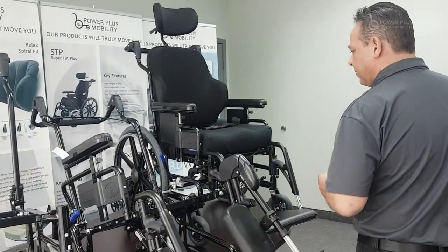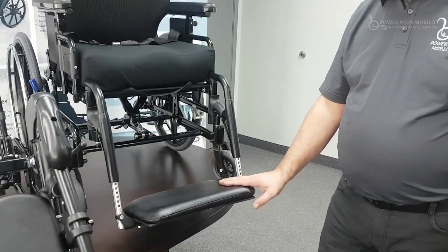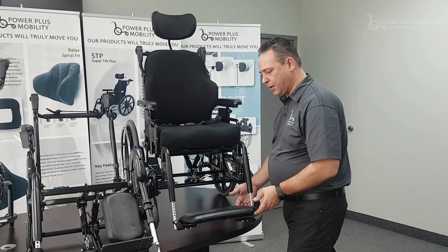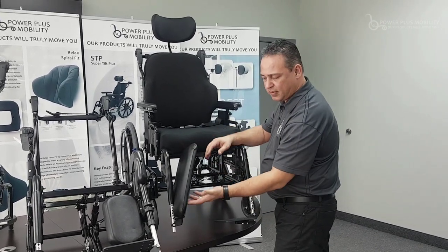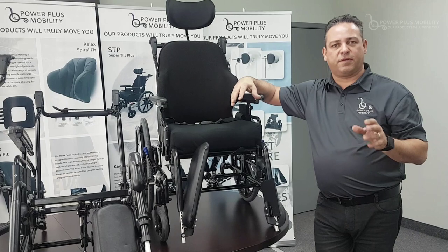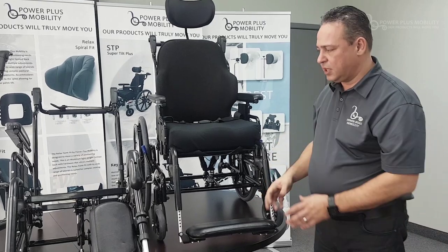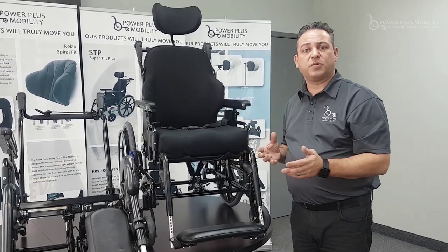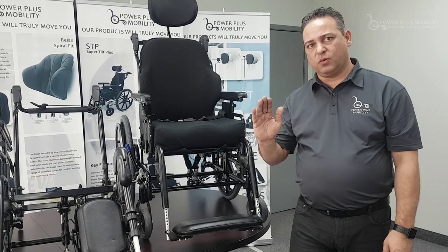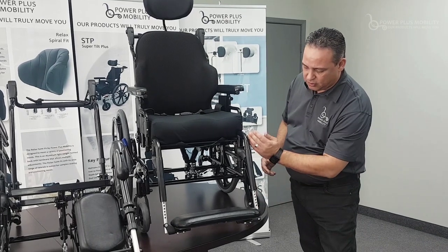Another option for front rigging is a footboard option. Although this is demonstrated on a tilt chair, this setup works very well on a folding chair — we can take our footboard, which is hinged onto the foot plate, and fold the entire chair. It also works well on a tilt chair because when you put it down it strengthens the front end of the chair and rigidizes it, giving it full support. The board is angle adjustable with the foot plates, depth adjustable, and height adjustable through all the mounts in the front rigging.